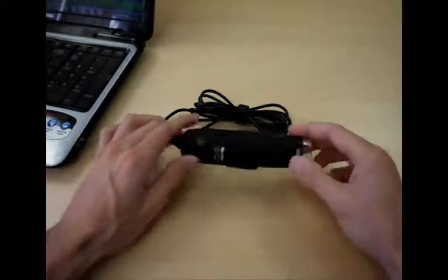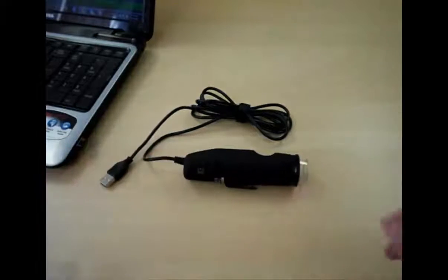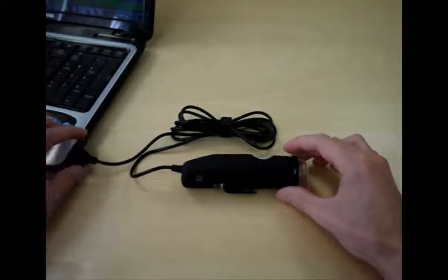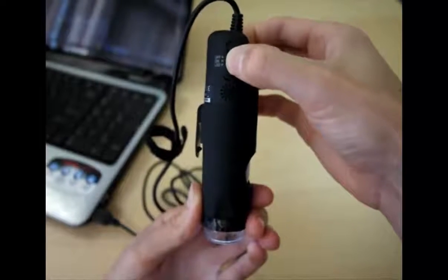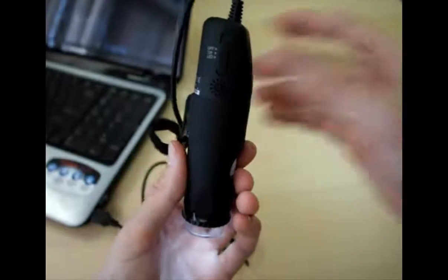This is your trichoscope. Start by connecting the USB wire to the USB port on the computer. Next, turn the device on. You can do this by going to this switch here and switching it to LED. This will illuminate all of the LEDs and turn the device on.